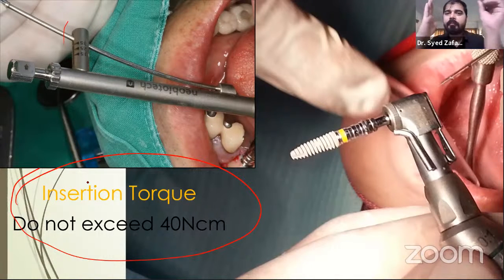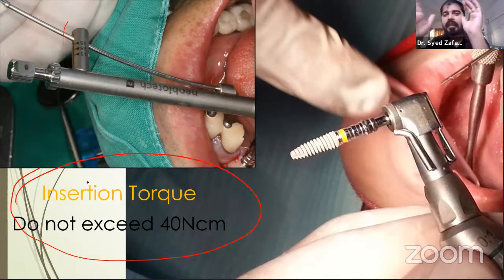Torque should be 30 to 40. If you have achieved 35 torque and the implant is in the bone, then this is the ideal recommendation. We assess the torque from here. This is almost 40 torque.